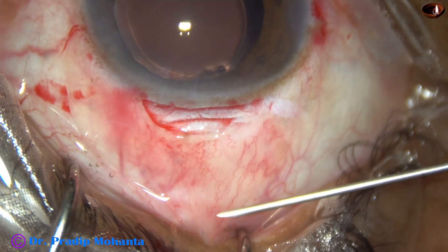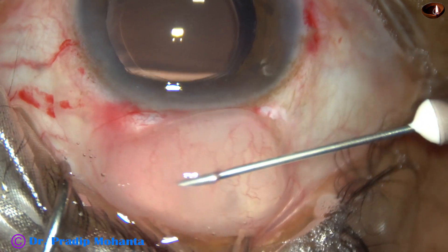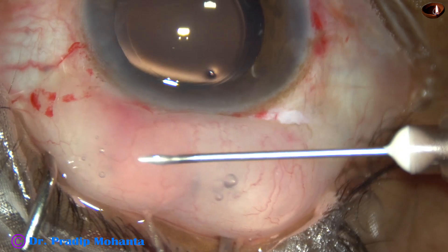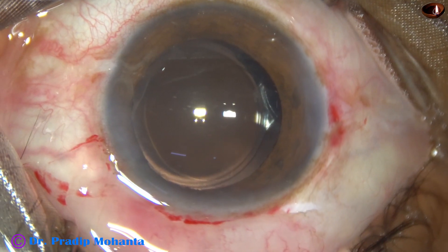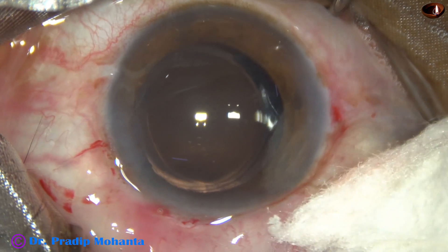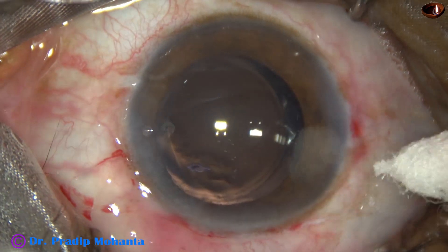It took longer than I would have taken for phacoemulsification. But this is an experiment and it shows that good quality surgery can be done manually. I have some post-op pictures — let us see them.